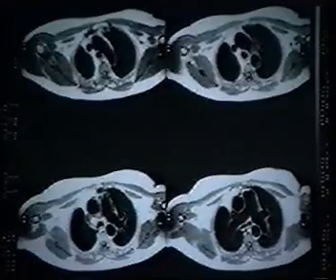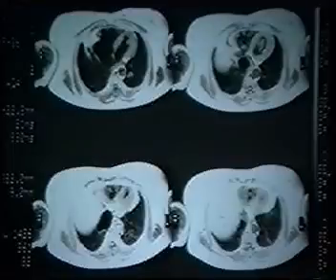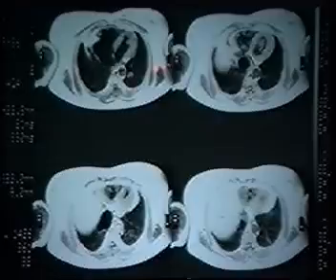The pulmonary artery here is perfectly normal. Notice, however, as compared with the CT, how difficult it is on these routine spin echo images to see the anomalous vessels in the right lower lobe. Because these are anomalous vessels within the parenchyma of the lung, you have no signal and no signal, and so it can be very difficult to identify. You can, in fact, see that there is an anomalous vessel joining here the inferior vena cava, but I think you can see that there is a certain problem, at least in some of these cases, in identifying anomalous vessels if you only rely on a spin echo technique.